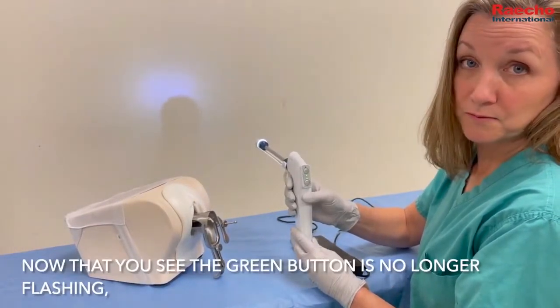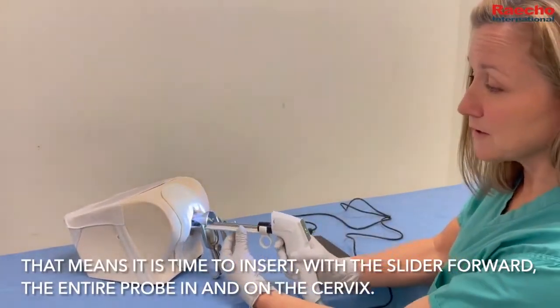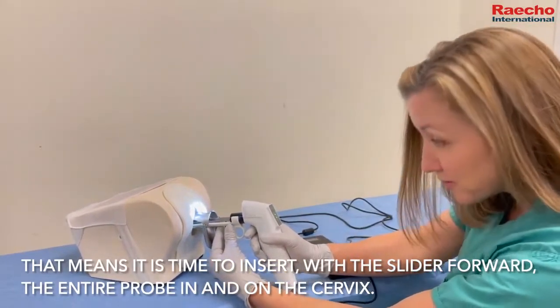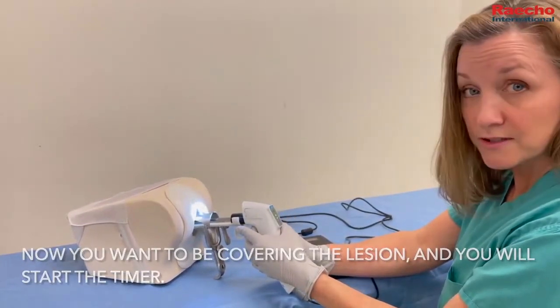Now that you see the green button is no longer flashing, it is time to insert the entire probe — with the slider forward — in and on the cervix. Make sure you are covering the lesion and start the timer.